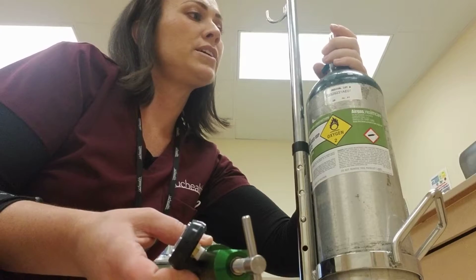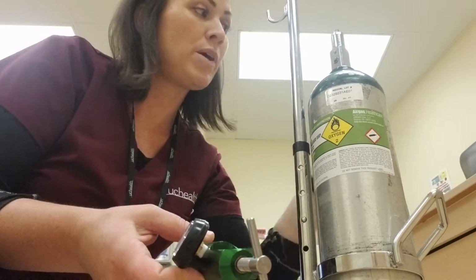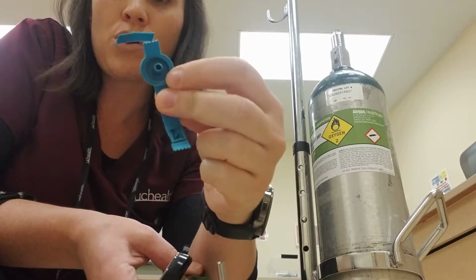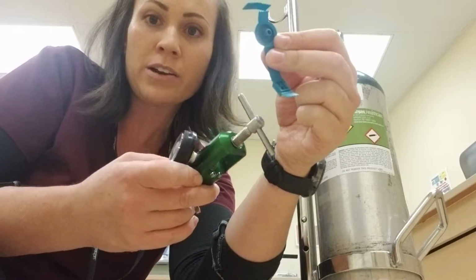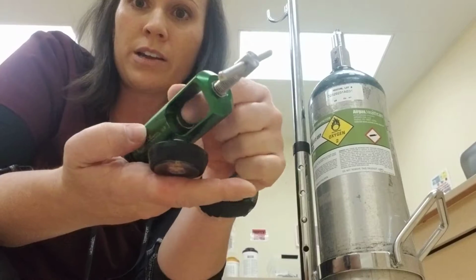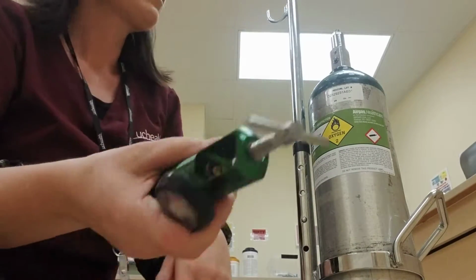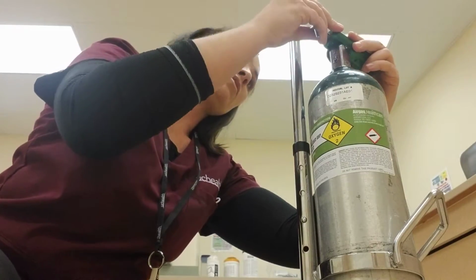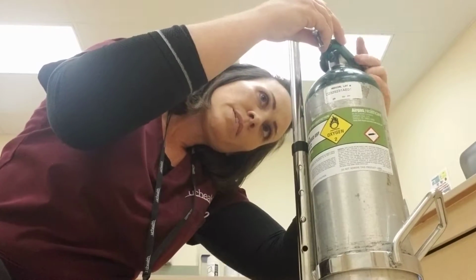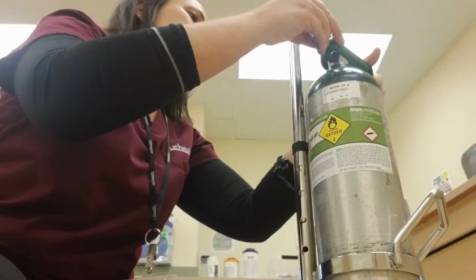We have a little plastic wrap that's around. We'll remove the plastic wrap. A lot of these have an extra O-ring in there. We're going to use that just in case we have a leak in the regulator, and we can replace that right on here. Okay, so I'm going to go ahead and put this regulator on, making sure that the pins are in securely and that the O-ring's lined up.